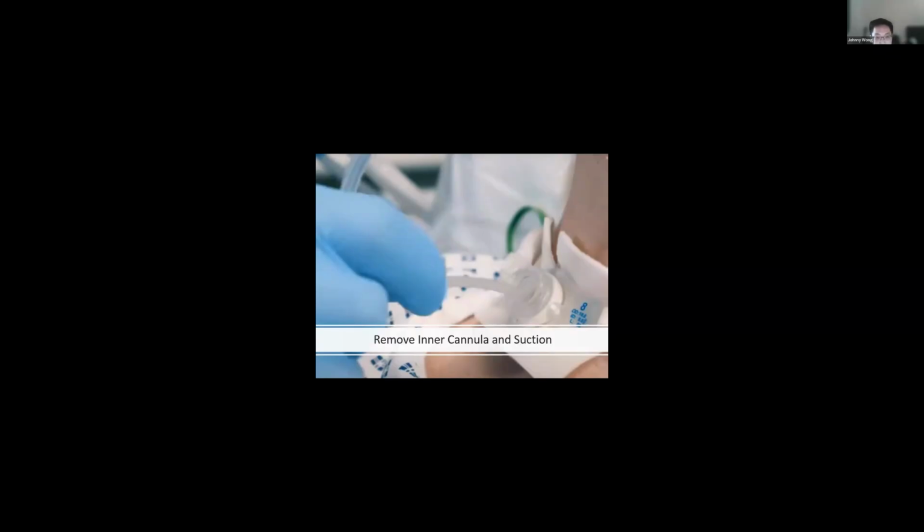But if you're not able to get it through more than a couple centimeters in, there's some sort of blockage, oftentimes a mucus plug. A lot of the trach complications are usually a mucus plug, so a lot of times it resolves from here.